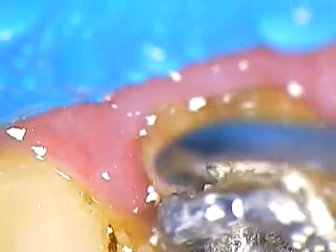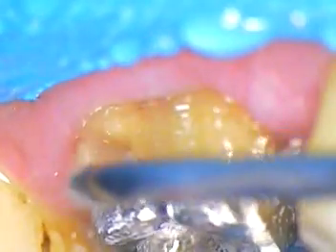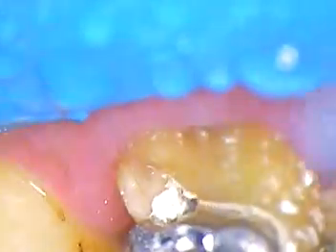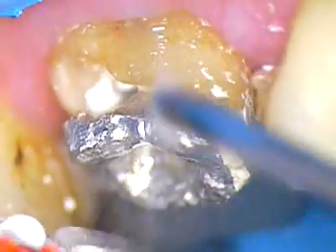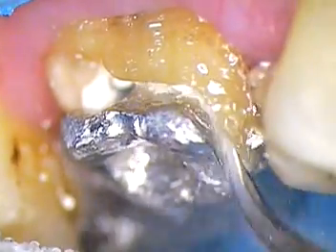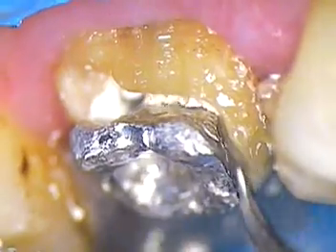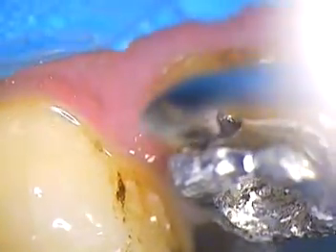Someone asked me, well, what's non-precious made of? So we're looking that one up today. I know I've used it very limited in my practice. Usually I'd like to see it in a softer material, like gold — high noble metal. But obviously it's very rigid. The post is in, probably with a zinc phosphate cement — it looked yellow when I went in there. Now our challenge is just to walk back through where we were at his last time. Notice there might be some movement, and if this thing comes loose, wow, that means a short visit today. We're also looking for any fractures that may be apparent and the unpredictable stuff.